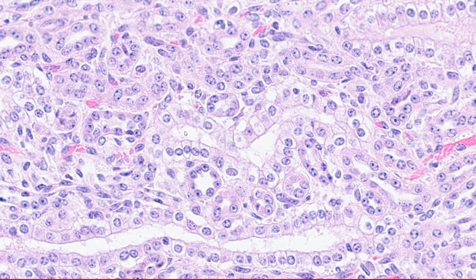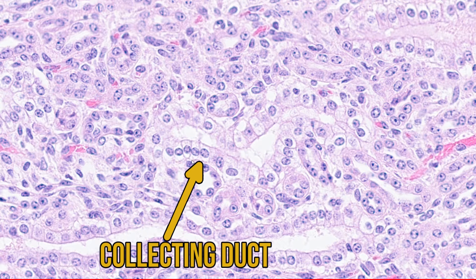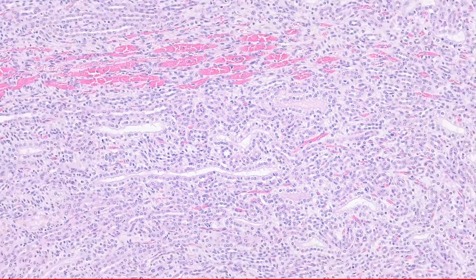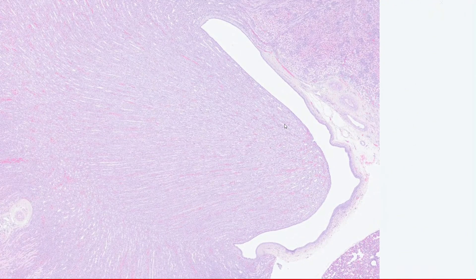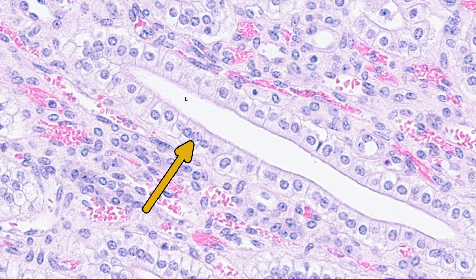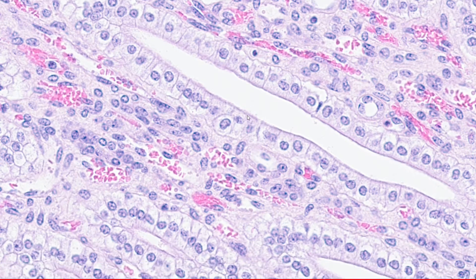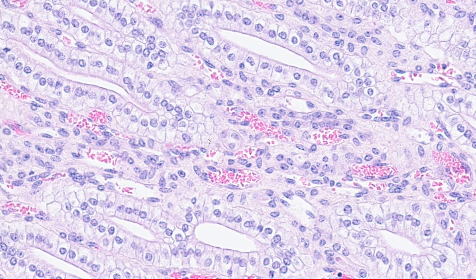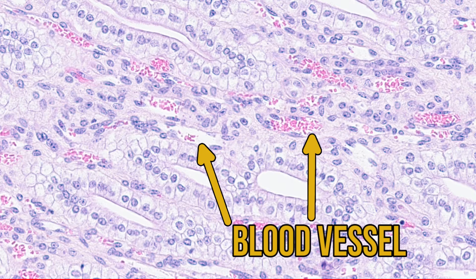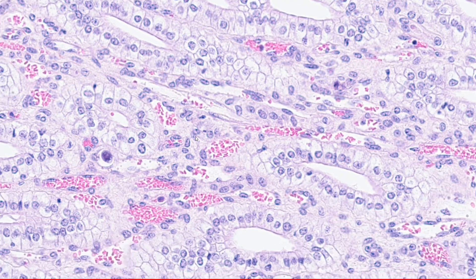Moving on to our last tubule type, the collecting duct — there's one just next to it. We have a big lumen, and lining this tubule we've got more columnar cells with quite vacuolated cytoplasm. Heading down right into the middle of the medulla, there's going to be a very large proportion of these collecting ducts with big lumens, columnar cells, and quite vacuolated cytoplasm. Interspersed with these are a few blood vessels, which may look similar to a thin descending or ascending tubule because of their endothelial lining, but they contain blood, so they're definitely blood vessels.